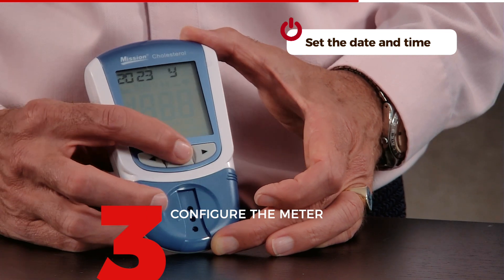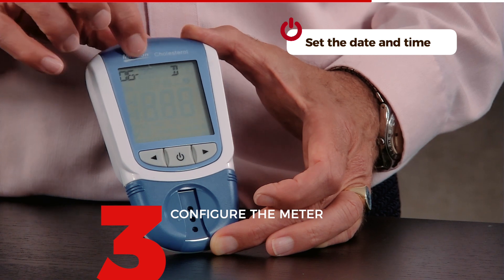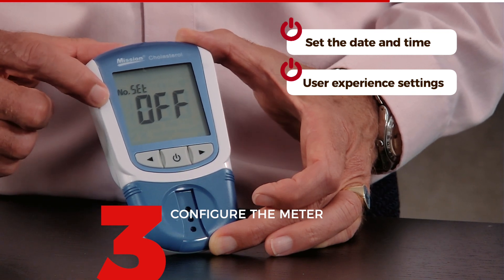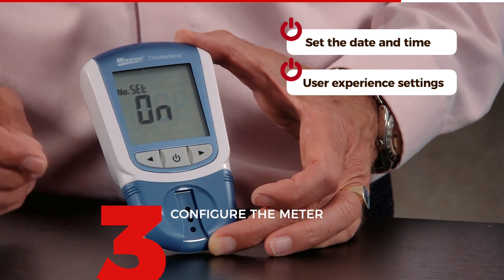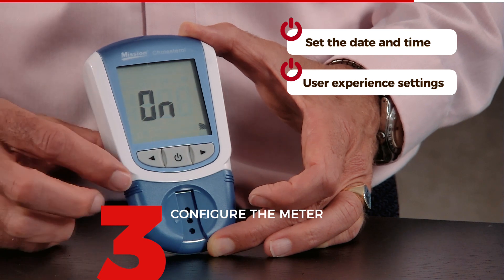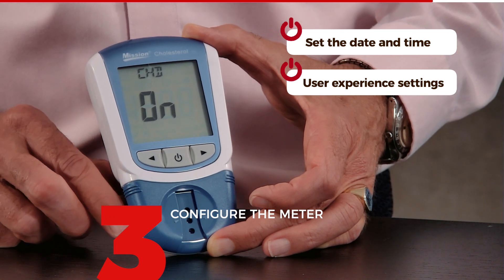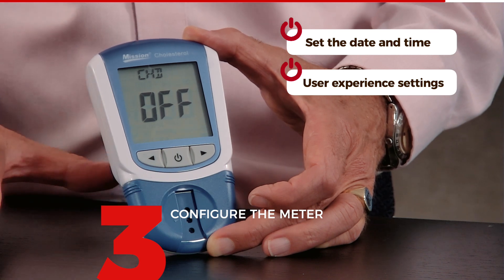I now see my earlier settings — it's 2023, so I press confirm. It's June, I confirm. It's the 25th, I confirm. I confirm the time. The next setting is number set off — this means the device will collect every measurement up to 99. I always put this on so every measurement gets a number, and then confirm. You then get the sound setting — I prefer to always keep the sound on, so I confirm on. The next thing is CHD for cardiovascular health risk measurement — I would recommend turning it off for standard use; you can read more in the manual.